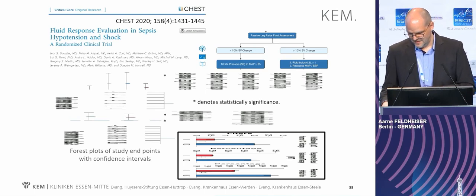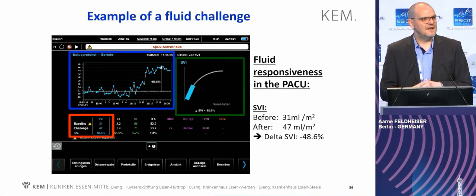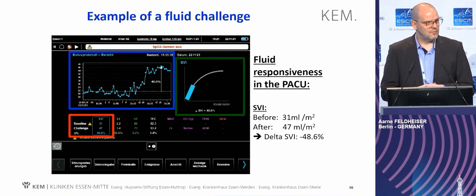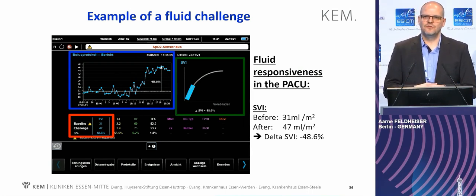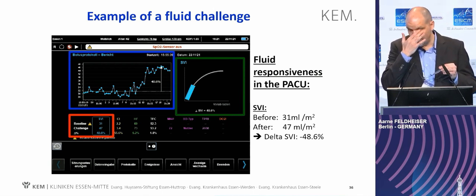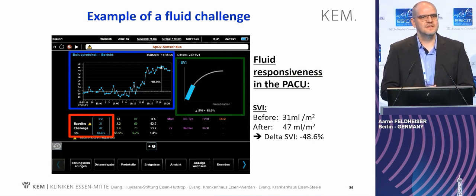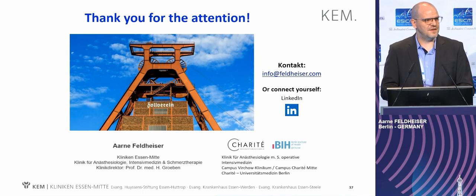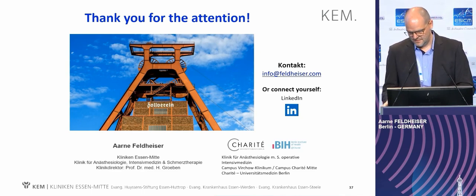This is a daily example from our PACU recovery area where, after being fluid optimized, I extubated the patient, went to the PACU area, and there I reassessed the patient. I recognized there was a stroke volume decrease, and at that point I restarted the fluid administration and had substantial benefits after surgery. Perhaps this might be the future, that we individualize care in the whole perioperative context based on such non-invasive monitoring devices. Thank you very much.